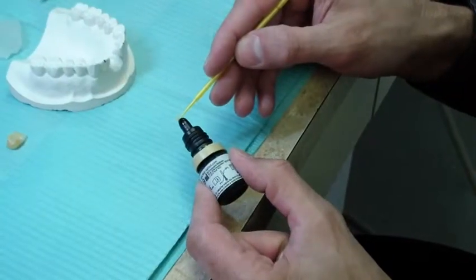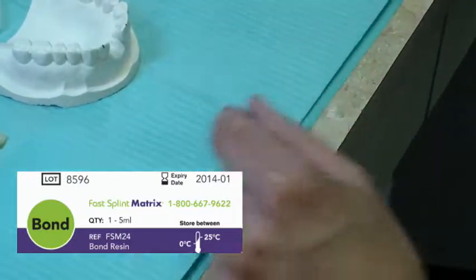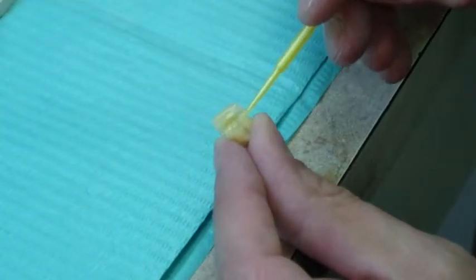Apply a coat of Fast Splint Matrix Light Cure bonding material inside the horizontal and vertical channels of the denture tooth and light cure for 30 to 60 seconds.